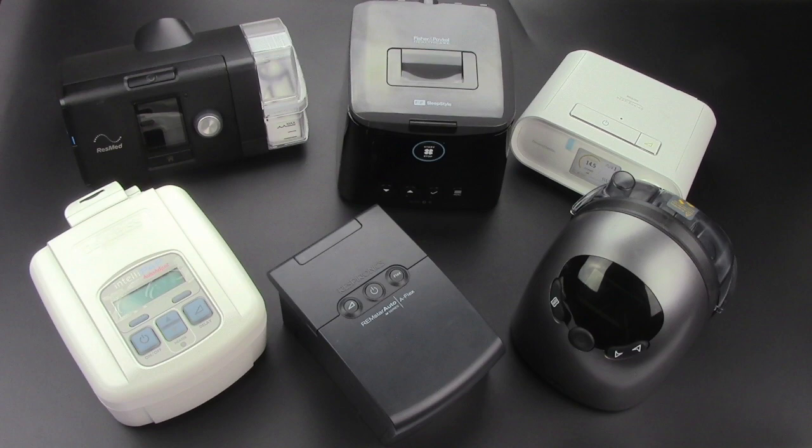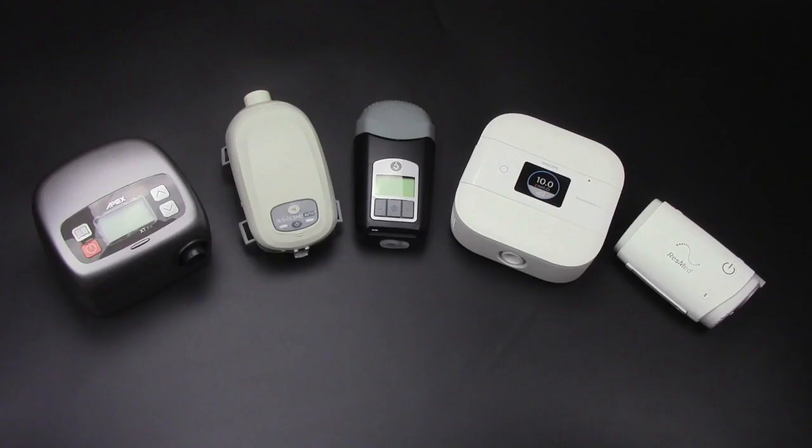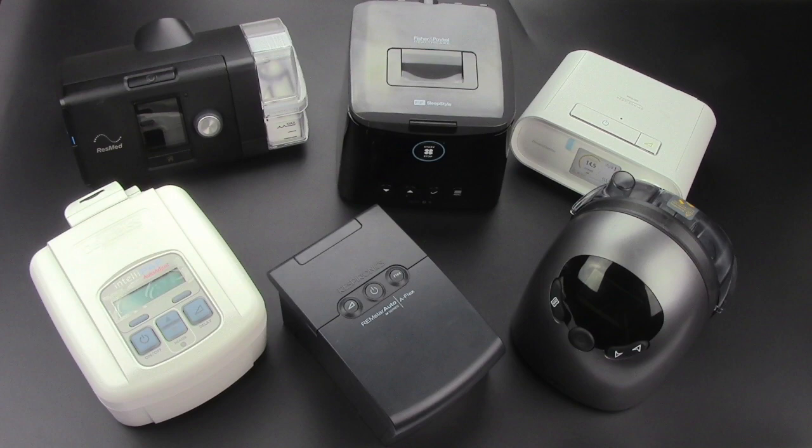Hi, in this video we'll be going over power options for all your CPAP devices. First we'll be discussing AC options, that being just the standard wall outlet that you'd plug into.